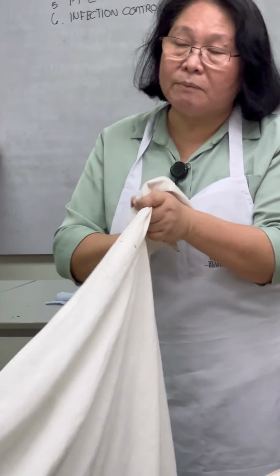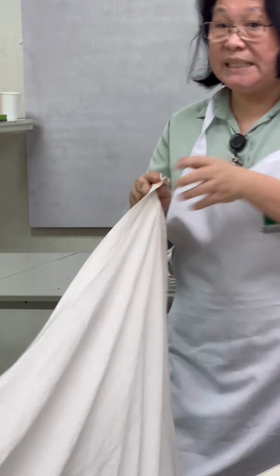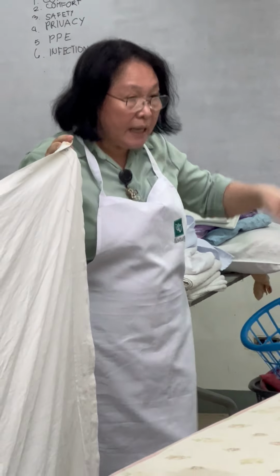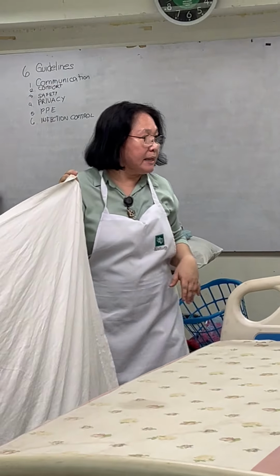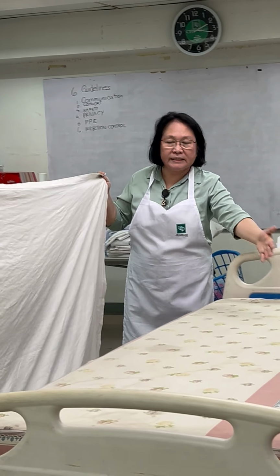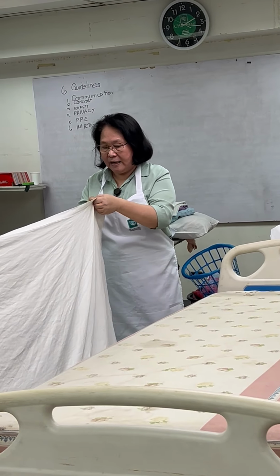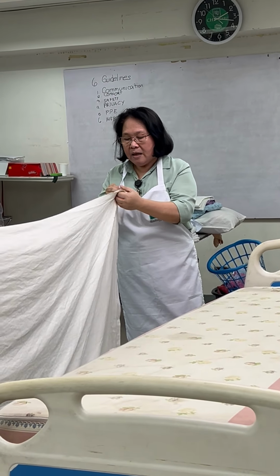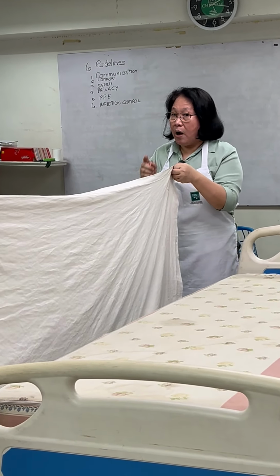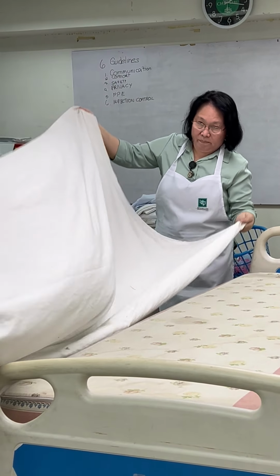So, if we fold the bottom sheet, it is good to good. Since I am here at my working area, why is it important to stay on one side? Because, look, this is our drop. This will be on your assessment. So, I am here on the right side. So, this opening is on my right side. Okay?